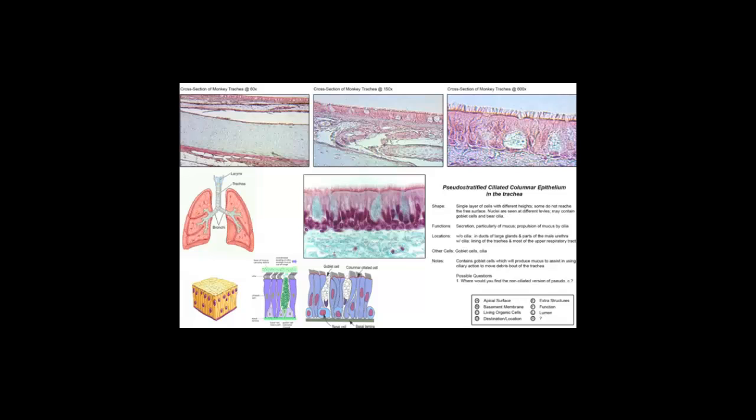As we look at this tissue at a low magnification, it's important to note that this is an excellent way to view multiple types of tissues, just about all the tissues at once, seen from the inner lining, where you would have, of course, the epithelial tissue, this tissue, the pseudostratified ciliated columnar epithelia, and the numerous different goblet cells that result in the pseudostratification or pseudostratified appearance that we've talked about already.